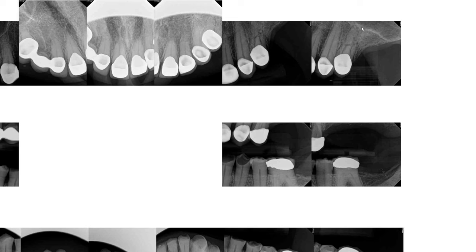Also recognize that the sinus floor has come down significantly, or that the ridge has lost significantly, so that the crest is now consistent with the floor of the maxillary sinus. If you were ever to place an implant in this area, you'd need some type of sinus lift procedure to increase the height of the ridge.